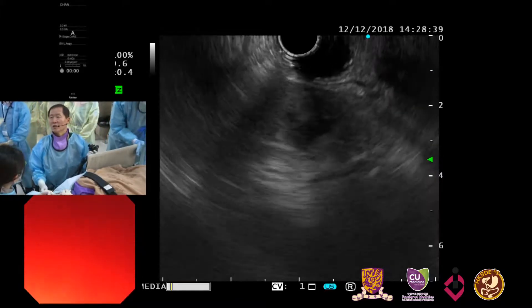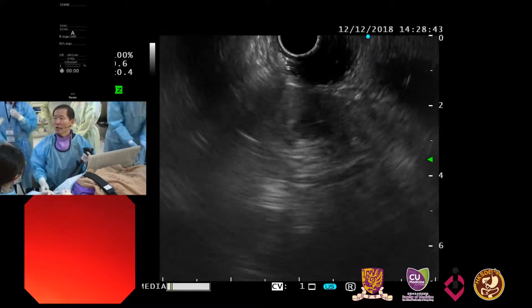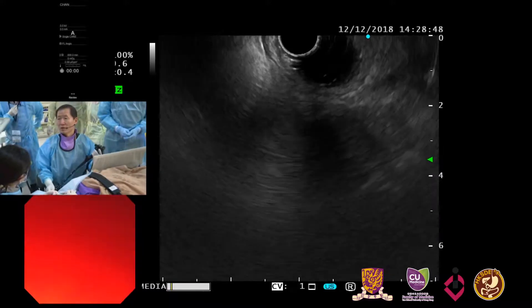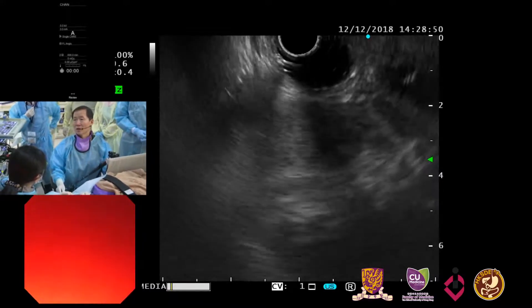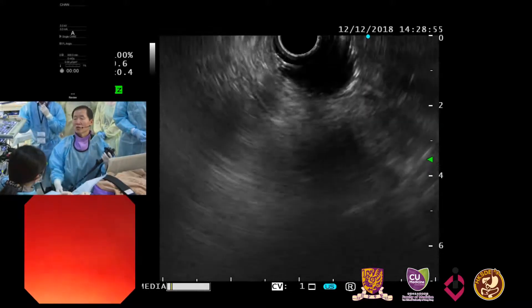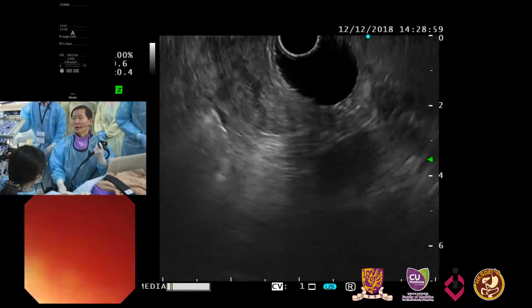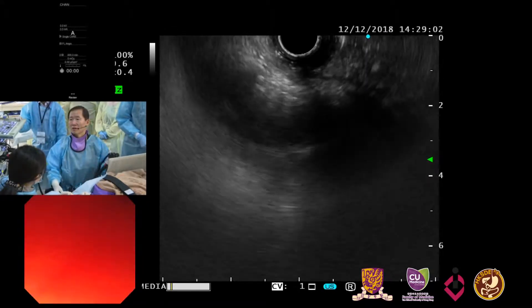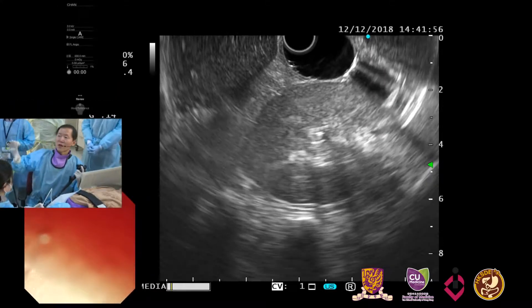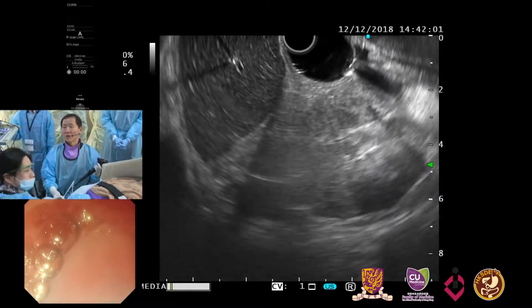The view is nice. This is the right kidney. We can see the medulla and the cortex of the right kidney. Our main task is the evaluation of the liver in this case. So I am slowly trying to retract my scope to interrogate the right side of the liver. The right kidney is abutting the right posterior segment of the liver.